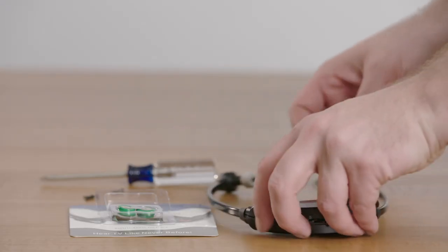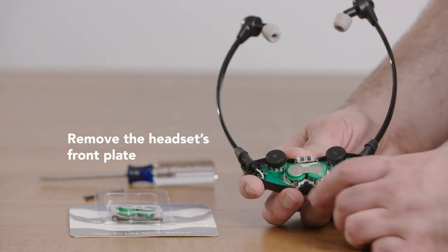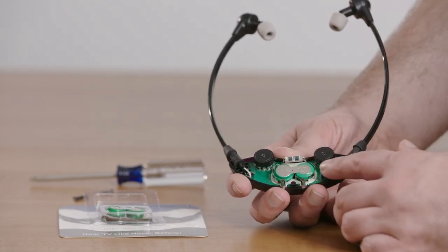Now once the screws are unscrewed we can remove the front plate from the headset and take a look on the inside. The battery goes into the circuit board here on the back half.